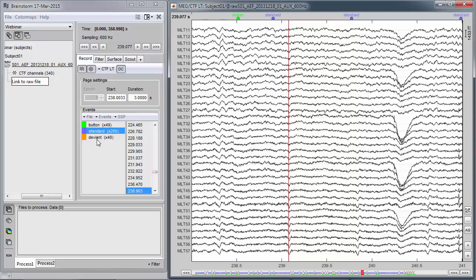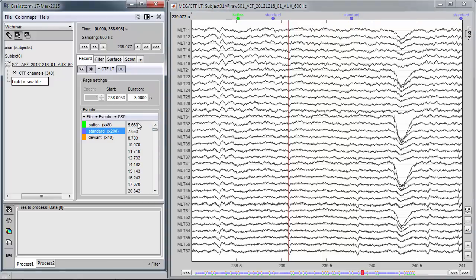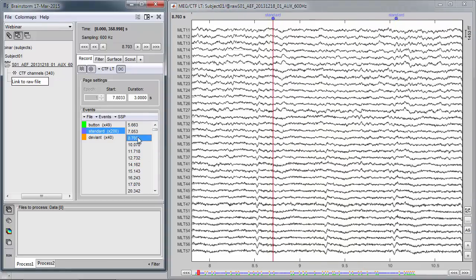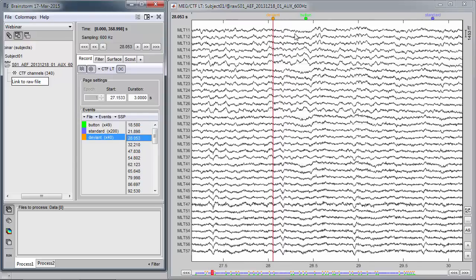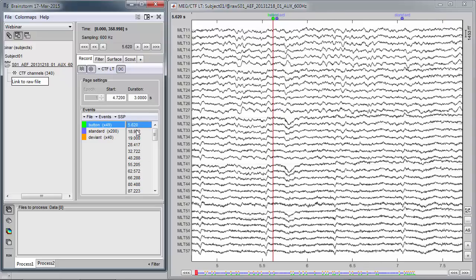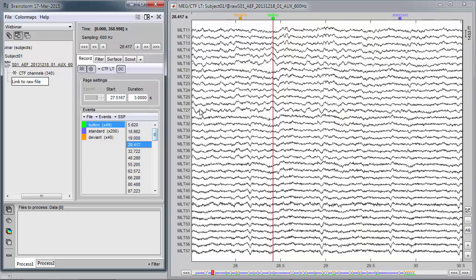Now a very important aspect of research and clinical work in electrophysiology: events of interest. This is gigabytes of data, but we may be interested only in specific events where a tone was presented — like here for standard, or when a deviant tone was shown. The events of interest are imported directly into Brainstorm. You have the three categories including the button press. And to the right, every time you select a category, you have the actual latency of when this event of interest happened in the file. I can click on any latency and the display updates automatically.